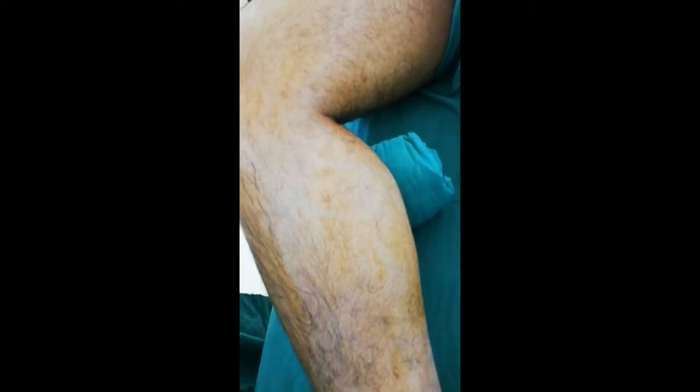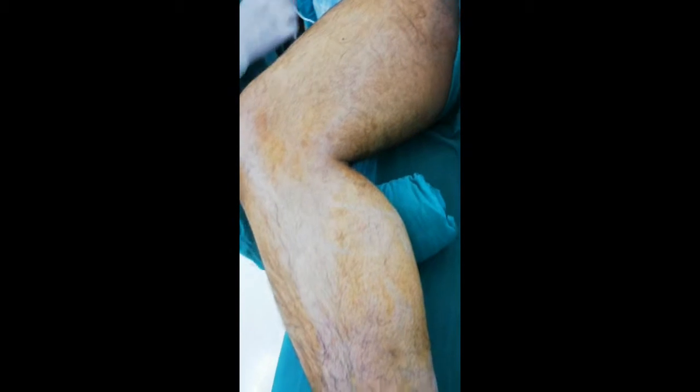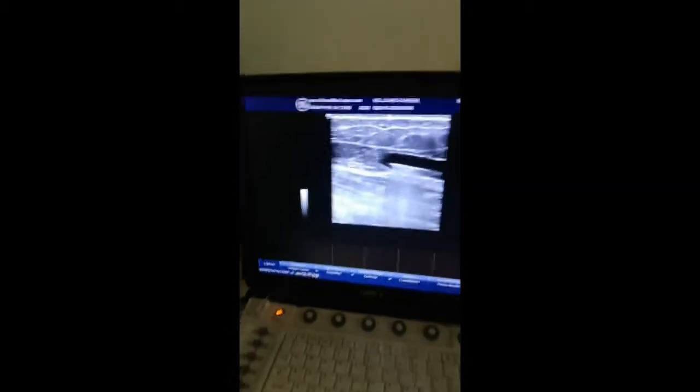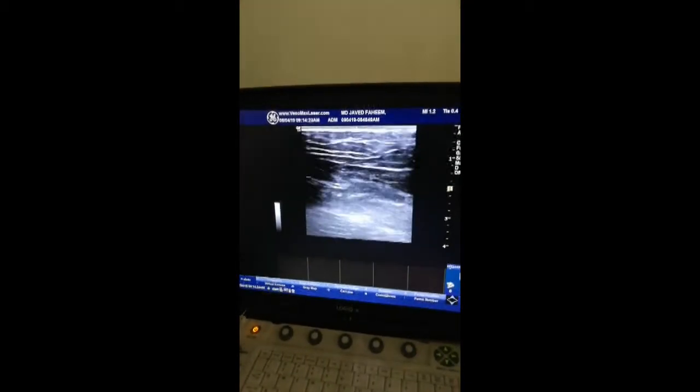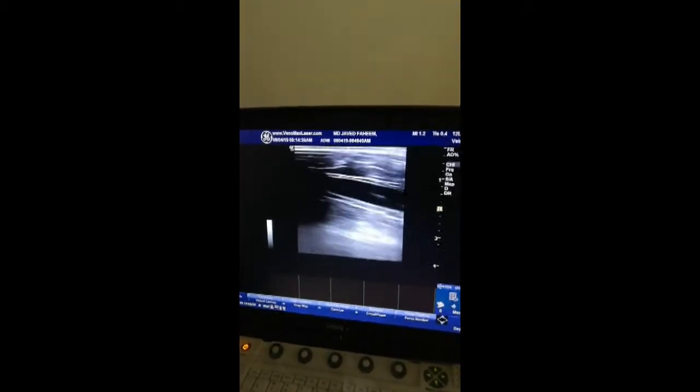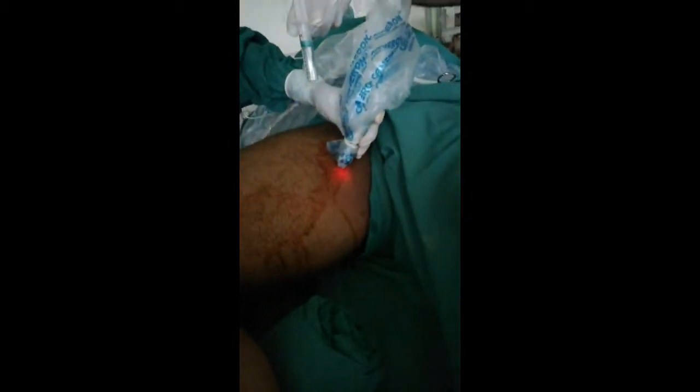Sometimes because of subcutaneous fat we may not be able to see the entire course, but we can see it now — we can see the light. You can also follow the passage of the fiber using ultrasound guidance; you can follow the light along with the ultrasound probe.